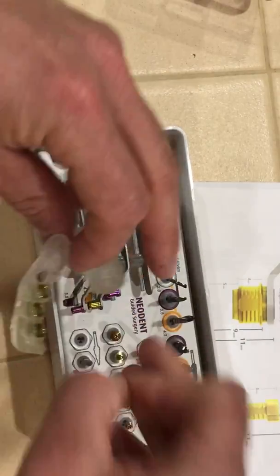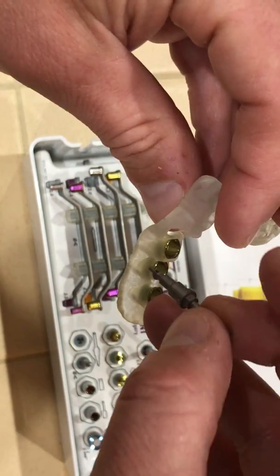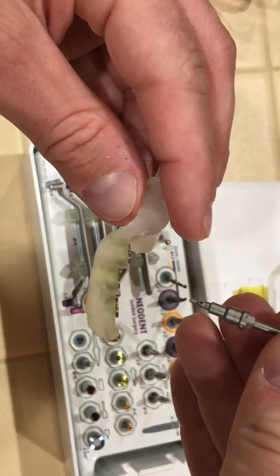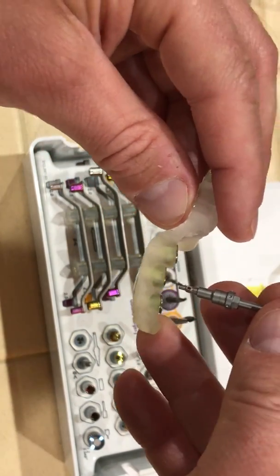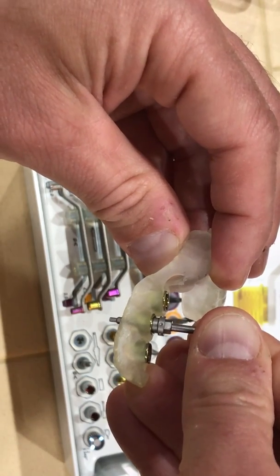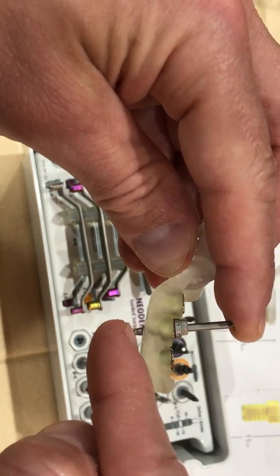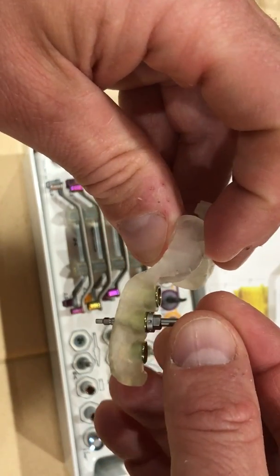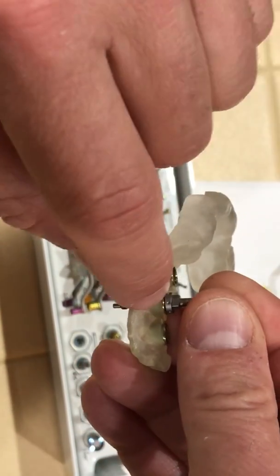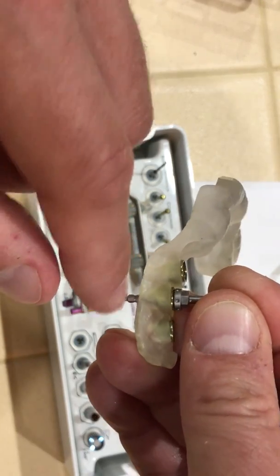On this regular sleeve in yellow, the first driver is the regular size — a little bit wider and it has these stops. The stops are huge on the side so that as we're placing the implant where the laboratory or the clinician places it in their software, two things happen. First, when the implant slowly spins down, we want to make sure we reach the same planned depth. Second, if we line the dot up to the facial — or wherever the lab marks the guide — we've also matched the hex, matching the internal hex timing of the implant.